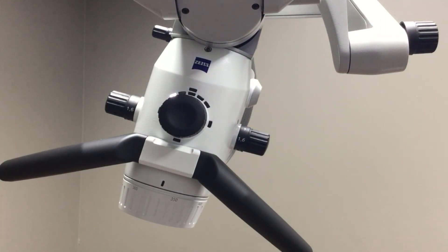the Mora keeps the microscope body at that angulation point, providing ideal ergonomics for the operator.